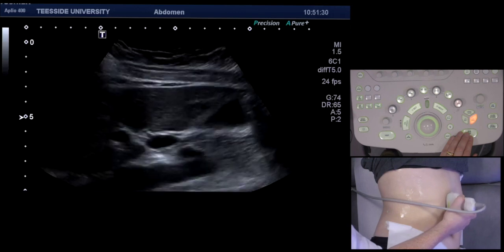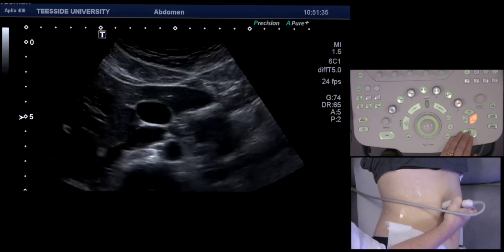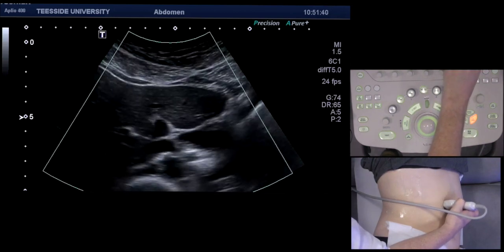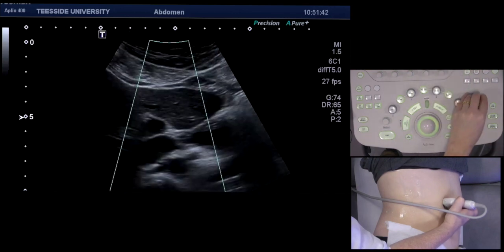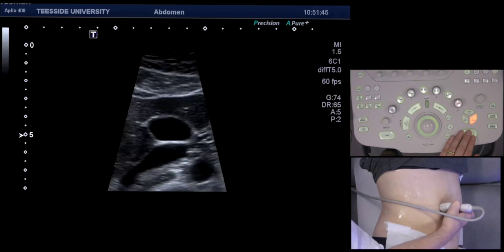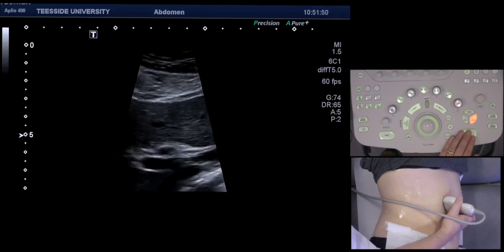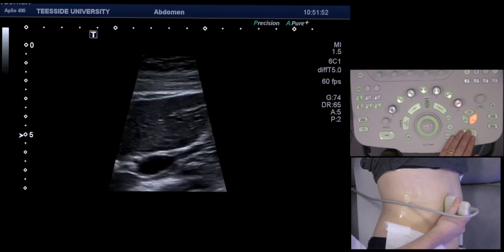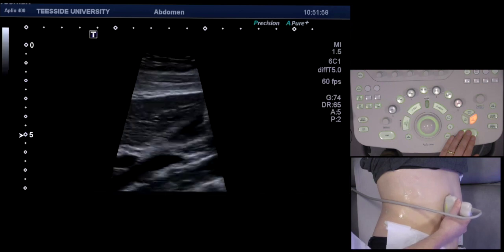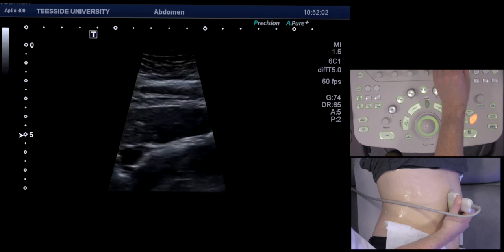I'm sweeping through in long section, making sure that I've seen everything, then rotating the probe and looking in transverse, sweeping right the way through. I'm now narrowing the sector width down so we can see the gallbladder in more detail. This is improving the resolution. Now we're going to have a really good look all the way through, and then we'll have a look for the common bile duct.